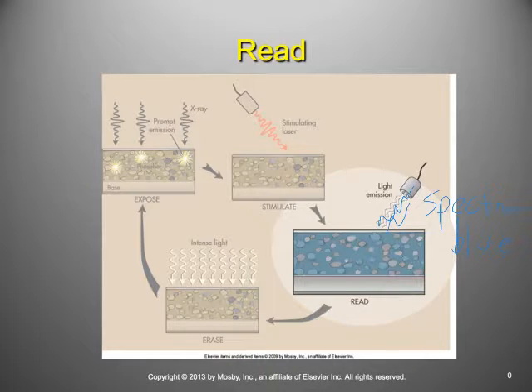This is significant. He doesn't really tell us why it's significant, but let me draw this out real quickly. So we've got a spectrum of energies. We've got this blue kind of discrete spectrum, and then if you're looking at the color wheel, from blue it goes to green to yellow to orange to red, right? And so this is very, very important from the computer's point of view. The importance of this is that there's a gap here, right? There's a gap between the spectrum of blue energies and then the very specific color of red that the laser is.